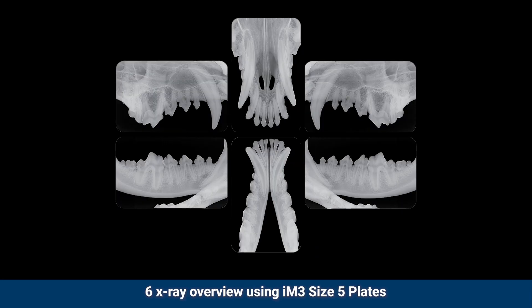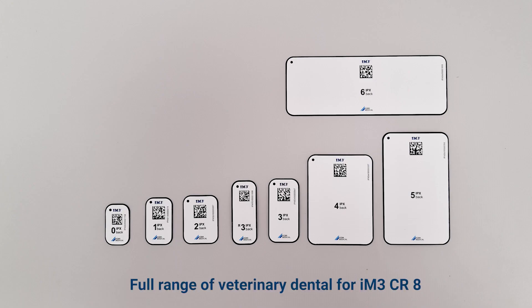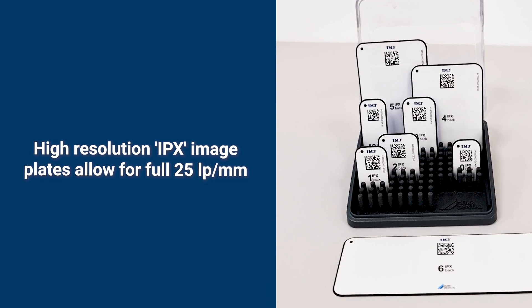Six X-ray overview using IM3 size 5 plates. A full range of veterinary dental plates is available for the IM3 CR8. High-resolution IPX image plates allow for full 25 LP per millimeter resolution.